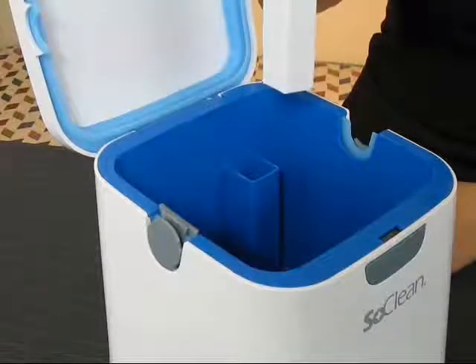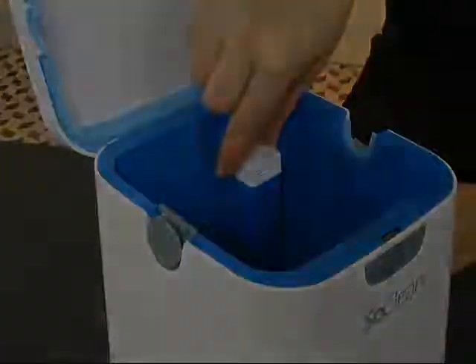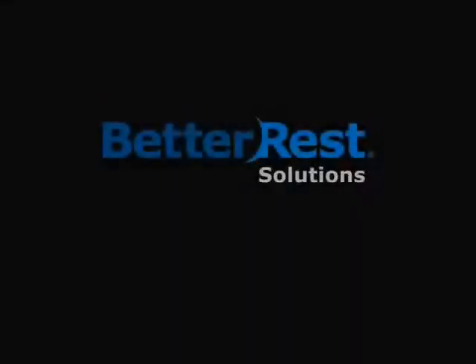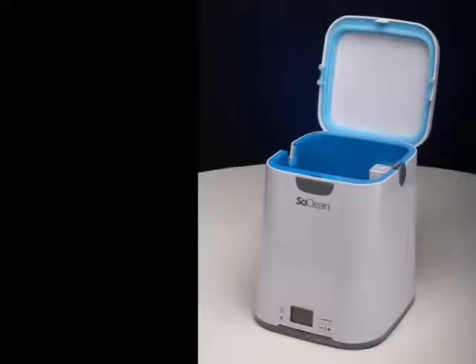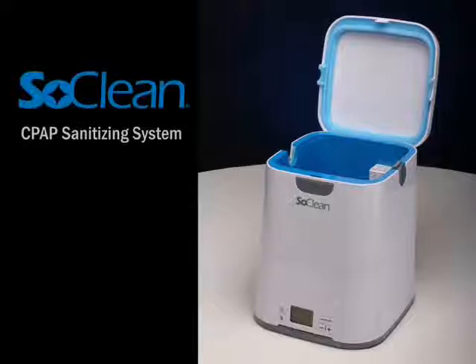Another item that we recommend replacing at the same time is the filter cartridge. Both of these items can be obtained on the Better Rest Solutions website or by contacting a representative directly. At Better Rest Solutions, we're committed to providing innovative and safe methods that can improve the health and well-being of our customers.